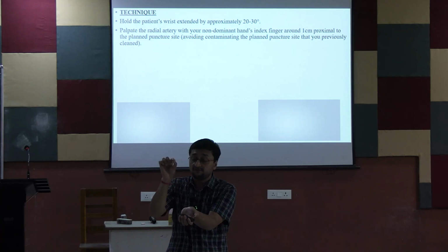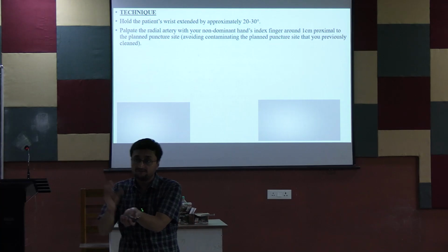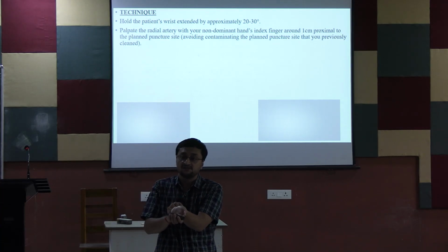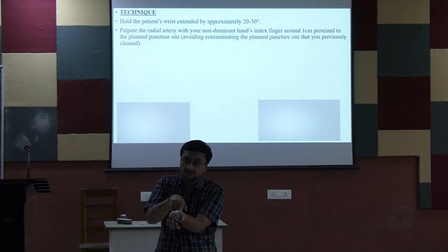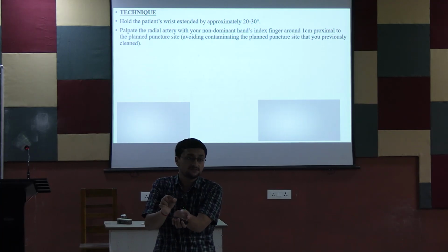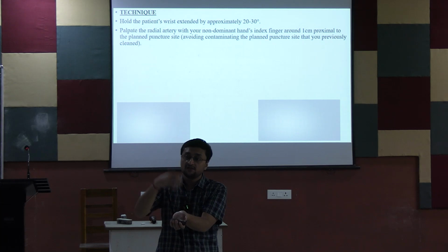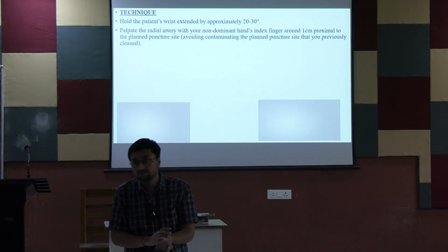যখন the first gush of blood will appear inside your needle, inside your syringe, after sudden loss of resistance, just insert করতে করতে দেখবি there is a sudden loss of resistance and gushing of blood, red blood. So that is arterial blood.